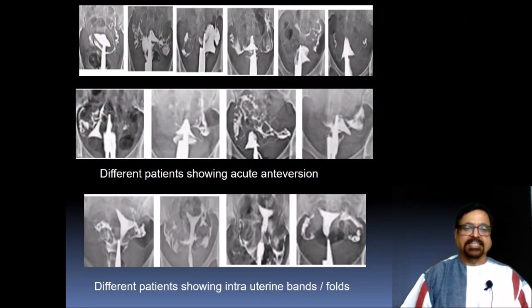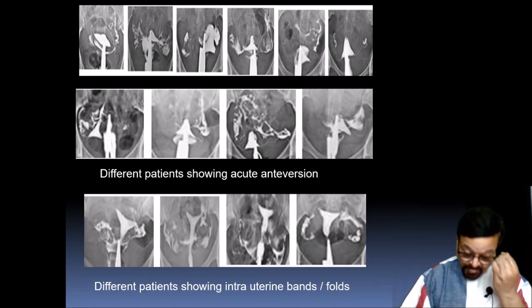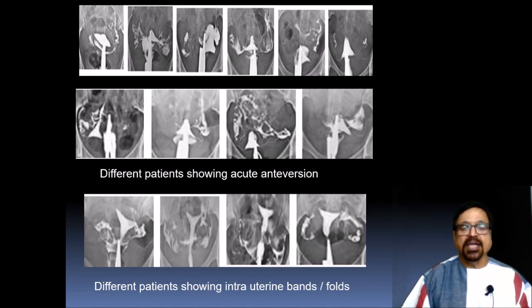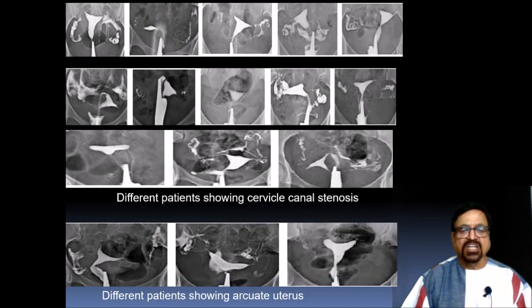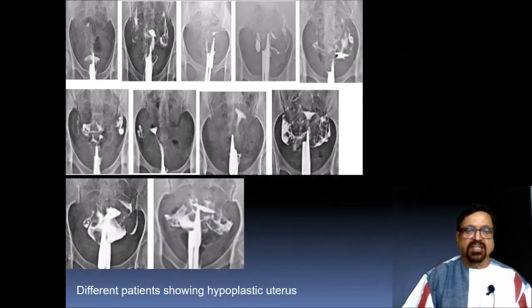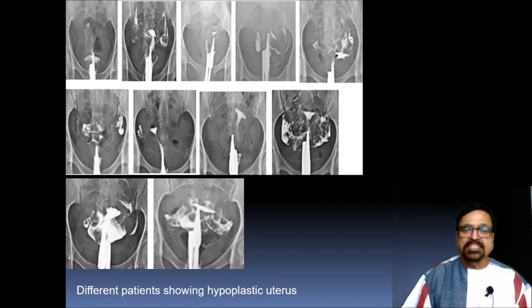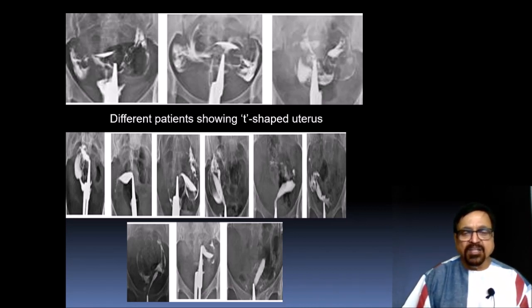We are now going to a film reading session — all images are from our own research paper. The first group shows different patients with acute anteversion. The second group shows different patients with intrauterine bands, adhesions, folds, or synechiae. Then different patients showing bicornuate uterus, different patients showing cervical canal stenosis, different patients showing arcuate uterus, different patients showing hypoplastic uterus, T-shaped uterus, and unicornuate uterus. Please go slowly through these images and try to analyze them yourself to develop diagnostic skill.